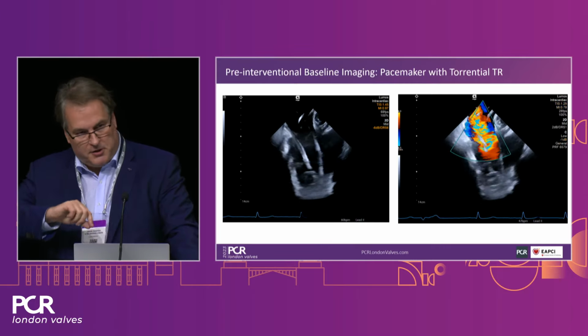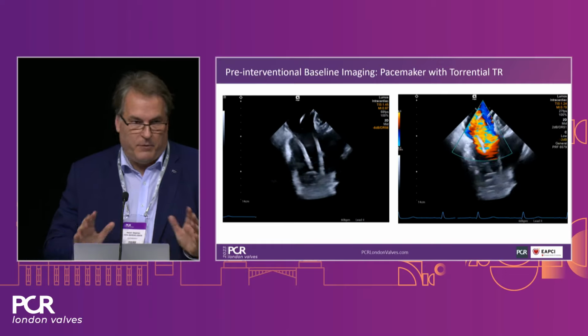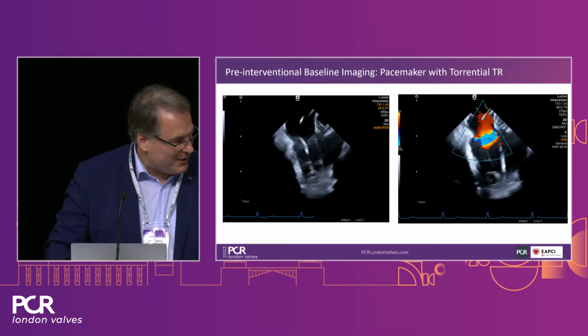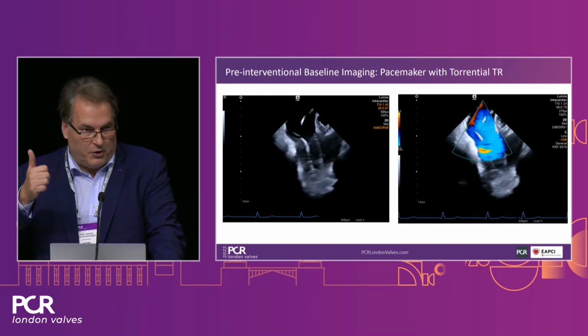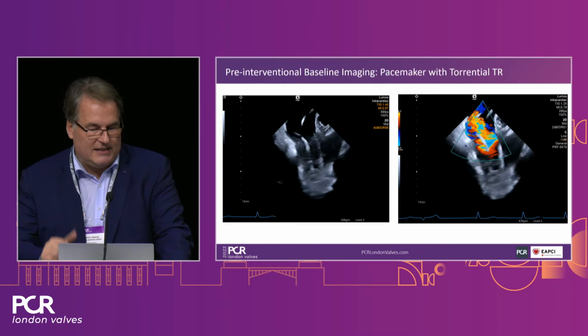If you look into the continuity of the pacemaker probe that you see here, even in a two-dimensional depiction, I think it's something we've never seen before. Yeah. And I want to highlight you to look on this also with the three-dimensional images that I will present in the upcoming slides. So I think we have a good temporal resolution. You agree, Francesco? We have a good spatial resolution. And we have an excellent color Doppler.